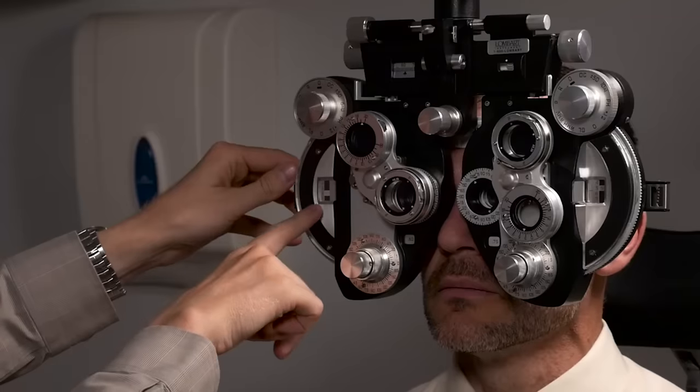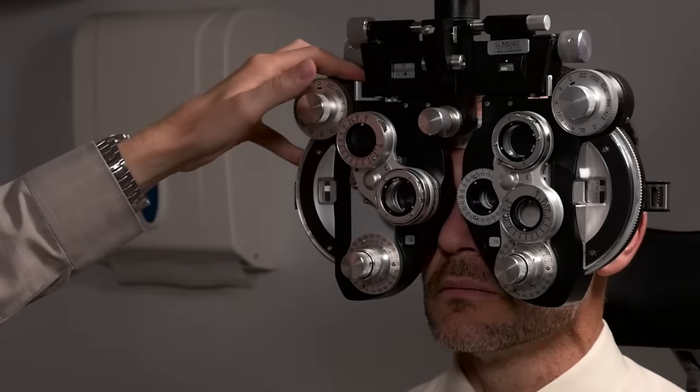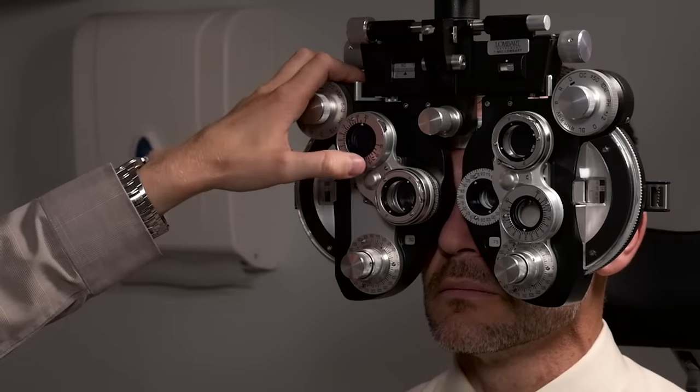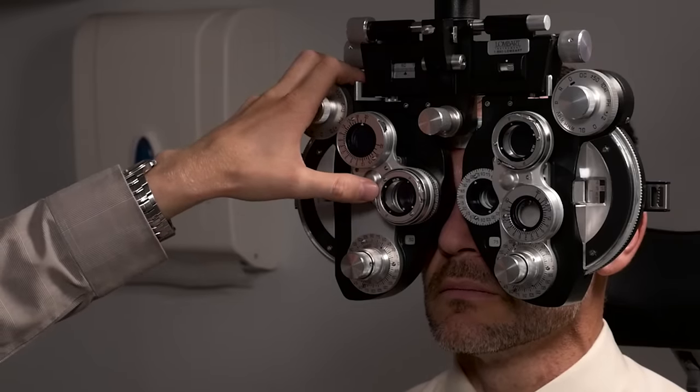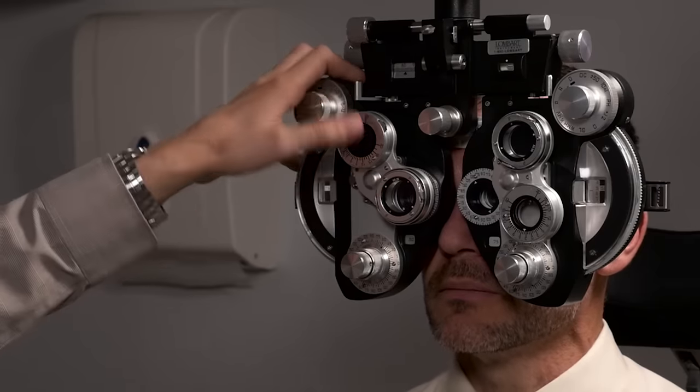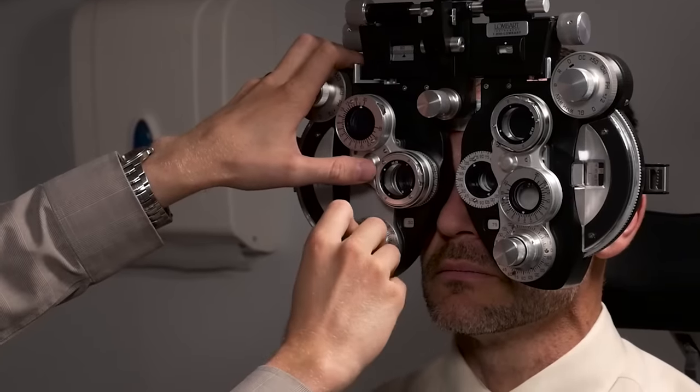Because I've added 0.5 cylinder of essentially minus because I'm taking away some plus, to compensate for that I have to add a quarter of plus here in the spherical component of the phoropter to maintain a spherical equivalent of the prescription. So we'll ask him again what's more clear? Number one or number two? About the same.